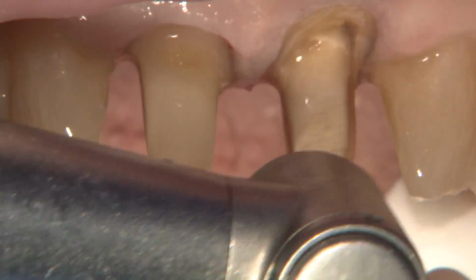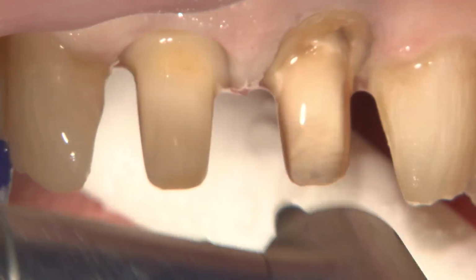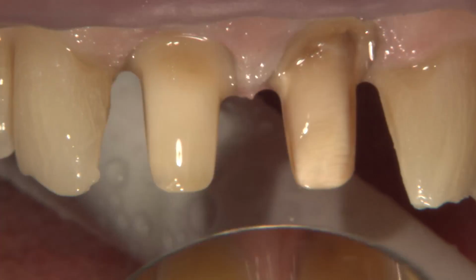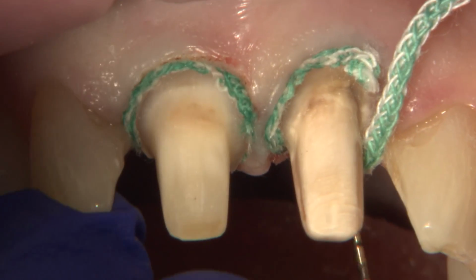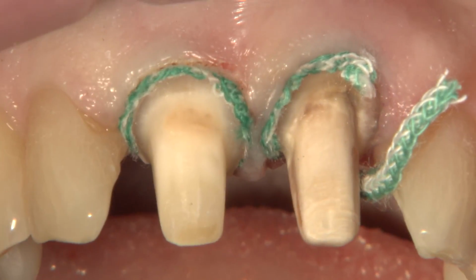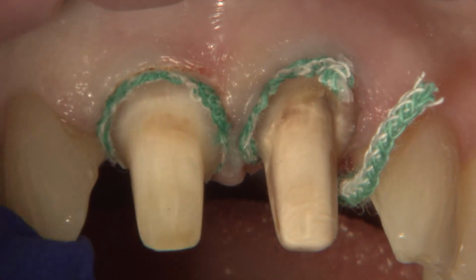Once the gross reduction on the preps is completed with a coarse diamond, I use a similarly shaped round-ended tapered diamond burr in a fine variety, so that I can go back and smooth off the preparations as much as possible. Once the preparations are completed, we will place the larger second cord for the dual cord technique, which helps displace the soft tissues away from the margins of the teeth.